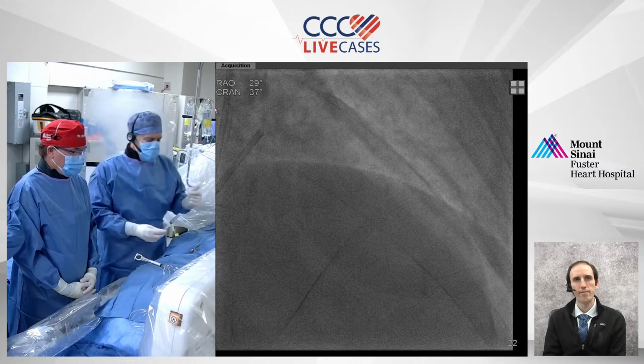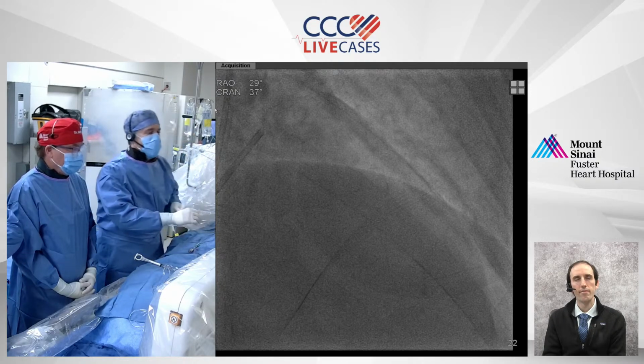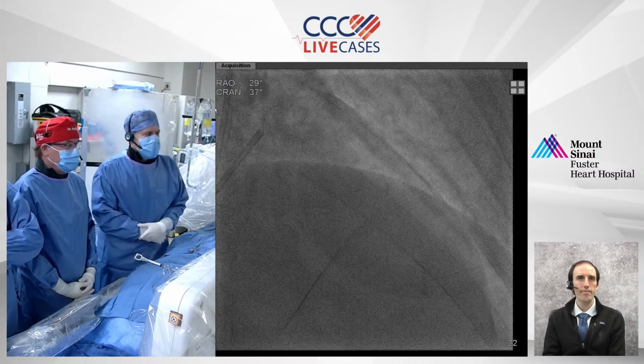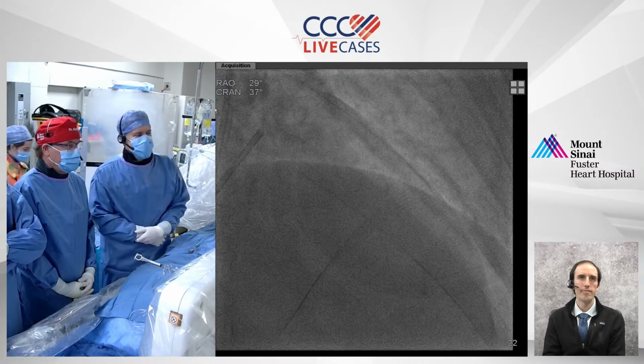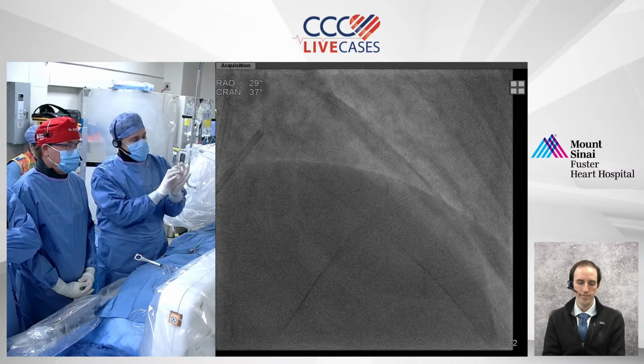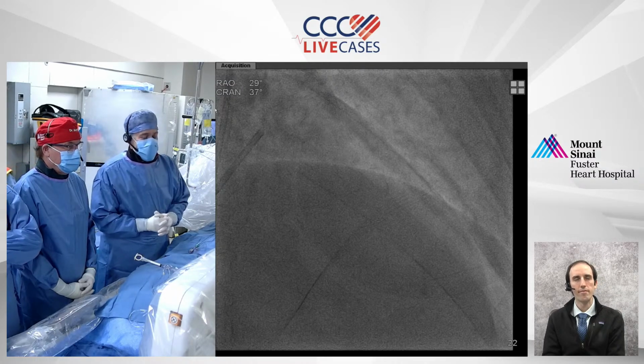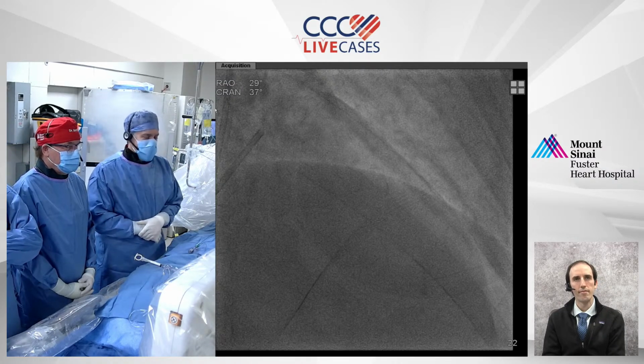Ashley handed me a 20 microgram dose, so we call this the endothelial dose. When we give this dose, anything less than the vessel staying the same in diameter or dilating would be consistent with endothelial dysfunction. So this is a 20 microgram dose.